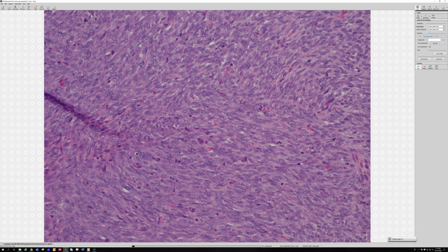CD56 and CD99 is also. Yeah, CD99 stains a bunch of stuff, right? Yeah, and I think people exactly. I tend to only use CD99 personally in the setting of a round blue cell tumor where I'm thinking of Ewing, and if it's negative, then it's probably not Ewing. So it's a very sensitive test for Ewing, but other than that, it's relatively non-specific, so I personally don't use it very often. I think pankeratin and EMA are great stains for synovial.